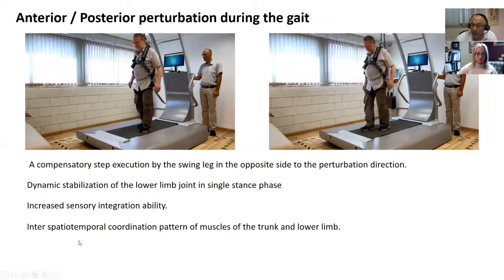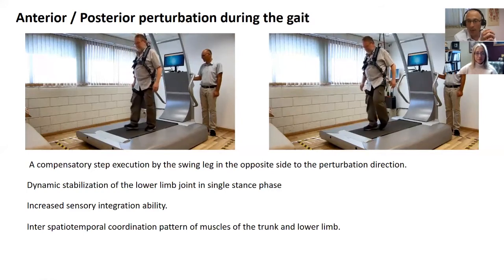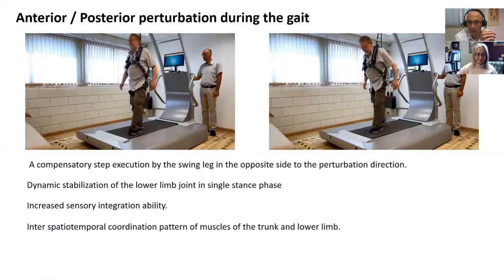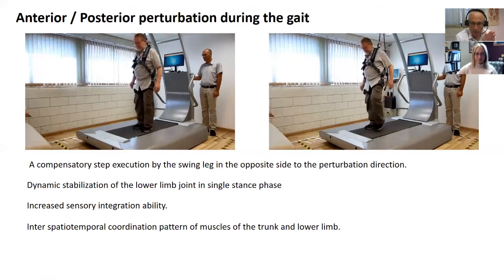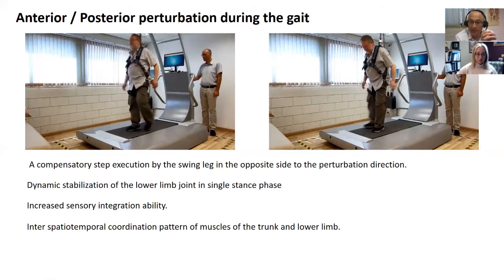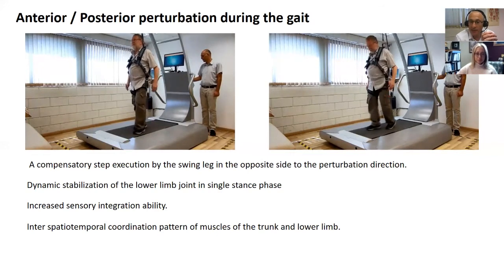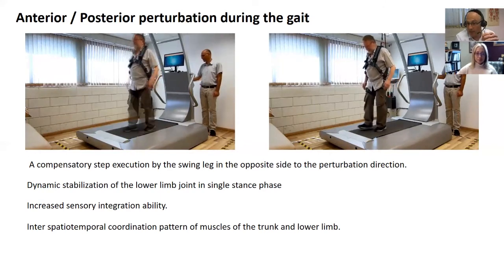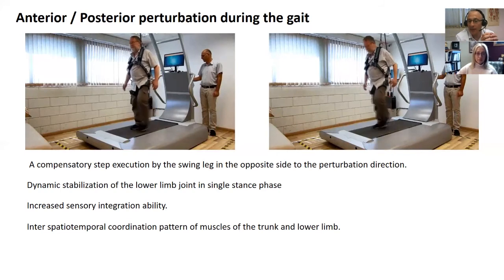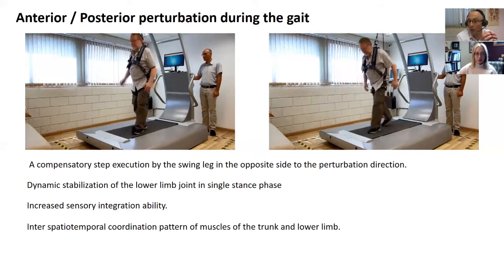Okay, and here we're seeing those same accelerations of the treadmills backwards and forwards as we're doing it during gait. Okay. Now, one thing to point out here, there's a couple of things that just came through my mind. The first thing is, if we want to increase stance or step length, then by giving a perturbation forward, depending on which leg is in the swing phase, we can increase the step length of the leg which is in the swing phase. Okay, and that's going to increase the amount of time that the patient is on the load bearing leg.